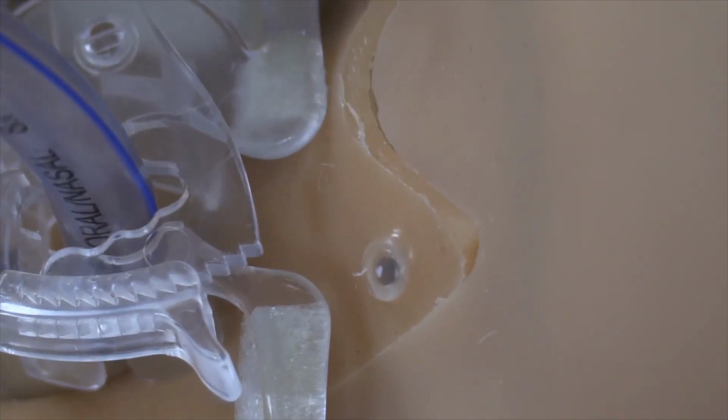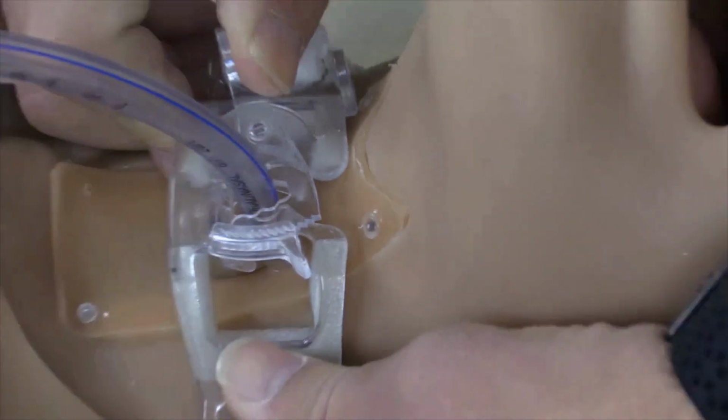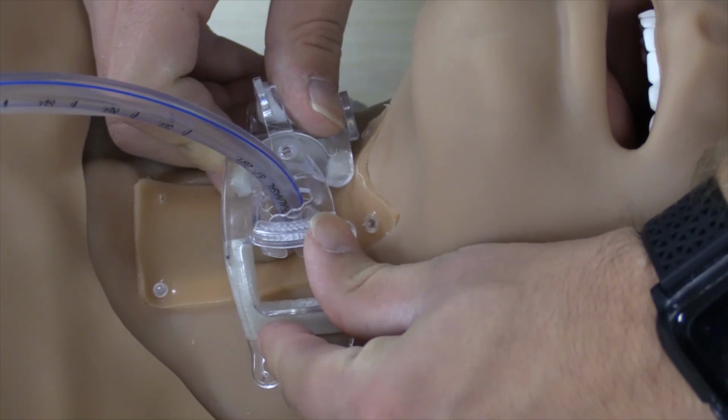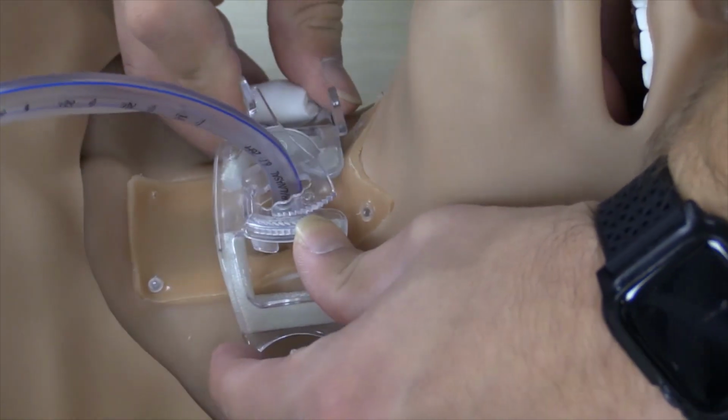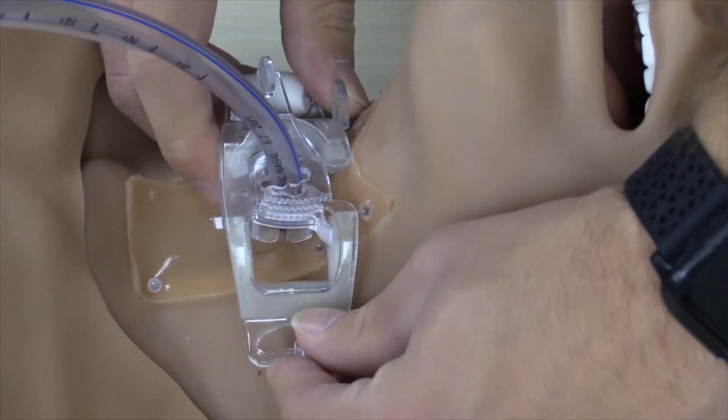I'm going to try to open it, and as you can see, it's not actually opening. If I want to release it, I can take this pull tab and press against it, and now I can release it. But it seems a fairly easy way to actually secure our tubes.